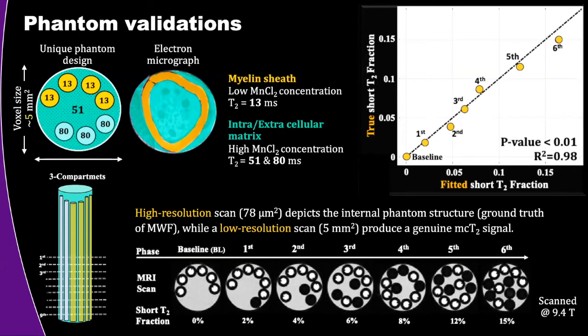Can you repeat this? So basically for the T2 star model, we have two contributions. One is the inherent, the intrinsic T2. The other is the T2 prime, which is from B0 inhomogeneity, right? So the underlying assumption of this GRE-based approach or this T2 star-based approach for myelin water fraction imaging is that the T2 prime component does not change for the myelin water component and the free water component. Is that true?